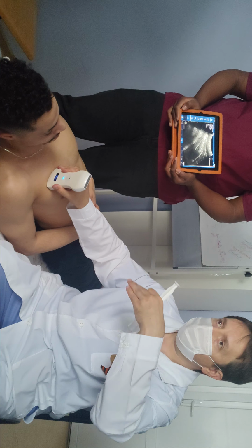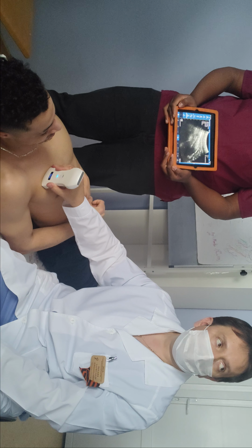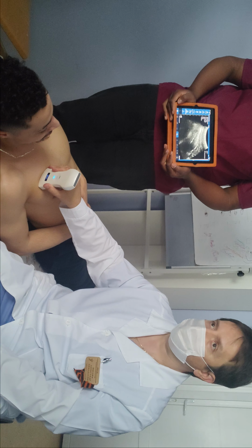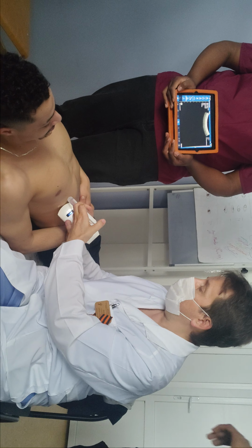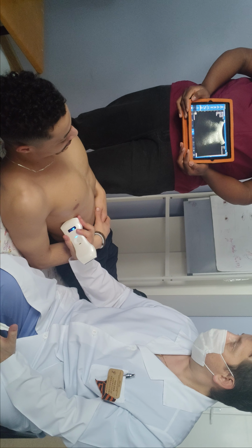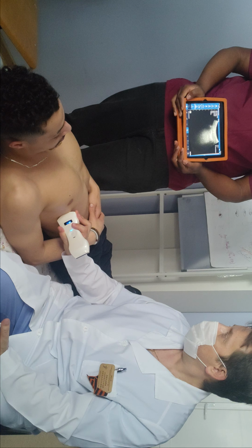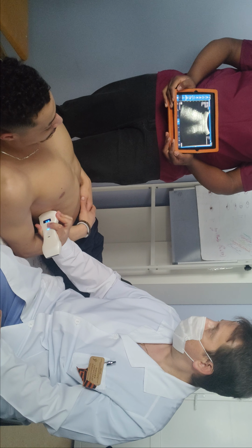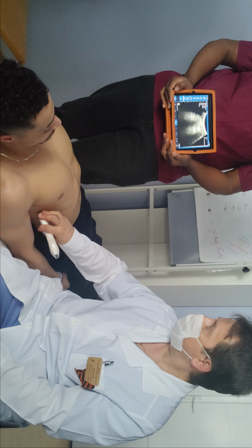It is a normal-looking lung tissue. Everything is perfect because he is healthy. Maybe a smoker, but we cannot see it just now. We can see it here if it is. If not, we cannot see it even here. We are sliding here, and here we have a spleen. It's not easy to find. That's why you should first focus on positioning. In some cases you will find the best picture.